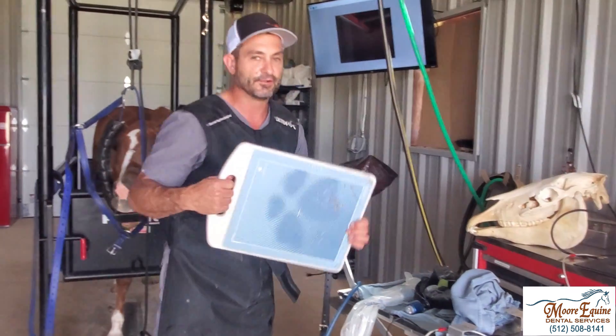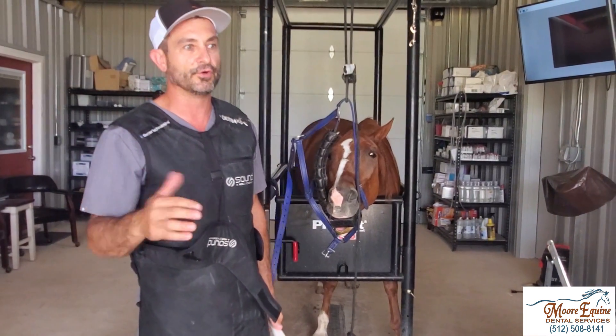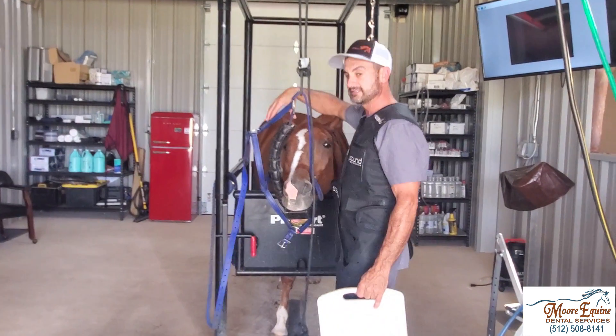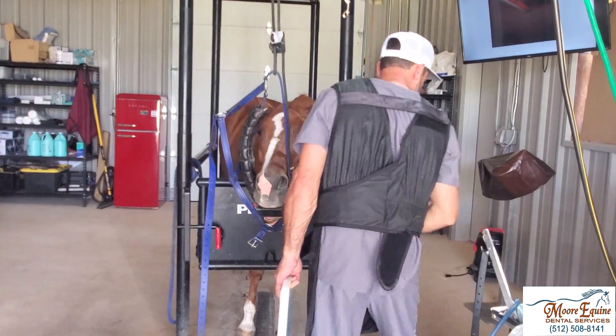I take these dental x-rays by myself all the time. It's easier obviously if you have a lot of help, but if you don't, don't let that stop you from doing what you need to do. The tooth in question on this horse is the 110, so we're going to be imaging the right side.